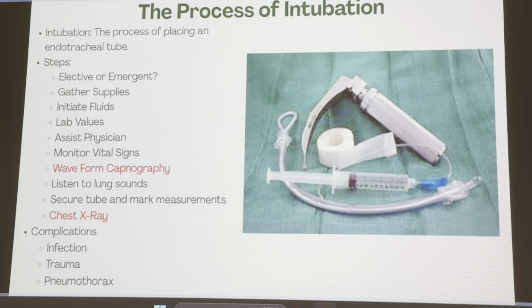So as those fluids are being infused, it serves a couple of different roles. First role is to maintain our blood pressure. So if our blood pressure drops during this procedure, I can bolus some fluids to give a little bit of extra volume to hopefully increase my BP. It also helps as a flushing mechanism, so I don't actually have to flush my line for the anesthesia drugs, the sedation induction type drugs. All right.